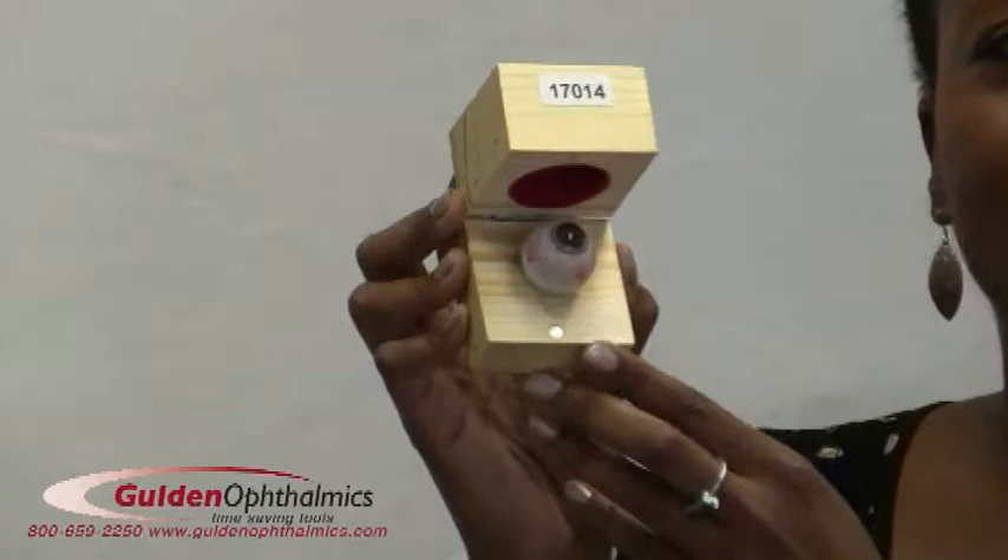The models can show normal and abnormal retinal findings such as diabetic retinopathy and retinal detachment. Also available is an anterior chamber practice eye that has been designed to allow exceptional viewing of the anterior chamber angle of the eye.